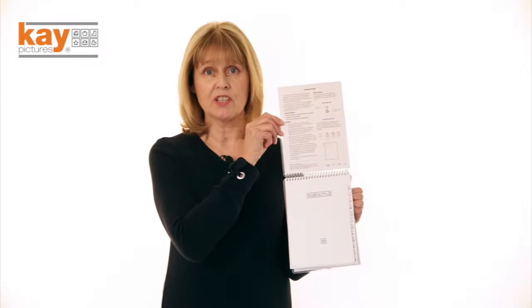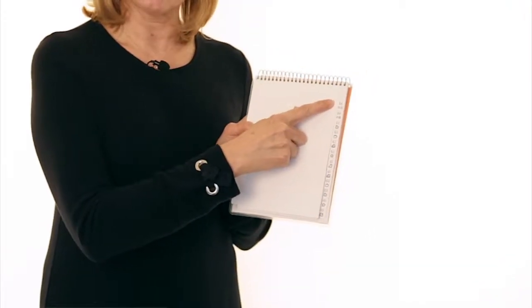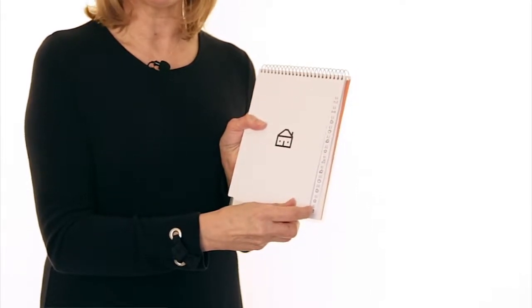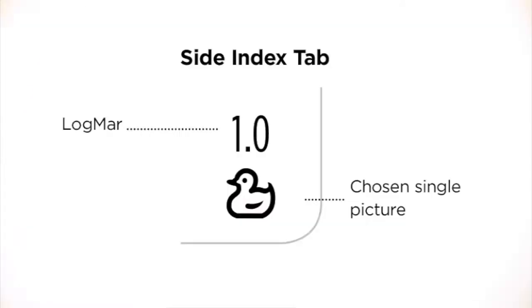Open the book from the front and you'll see the instructions are printed on the inside covers. When you open the book, there's a tab on the right hand side and it shows the picture and an acuity size from 1.0 to 0.5. These pictures are uncrowded and will give you an estimate of the child's vision.